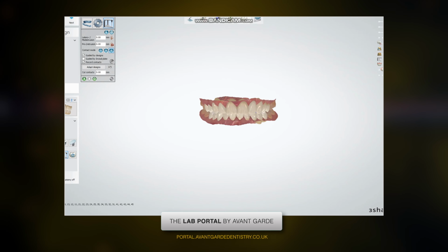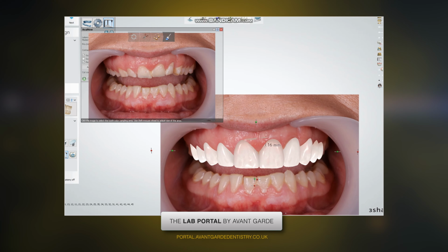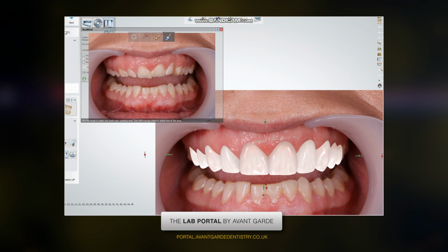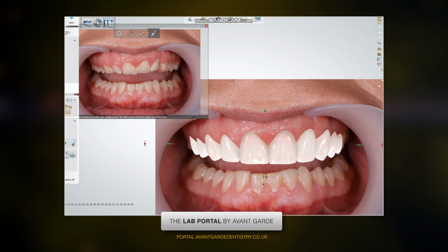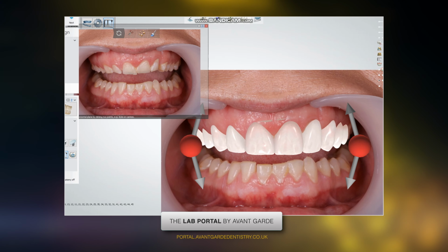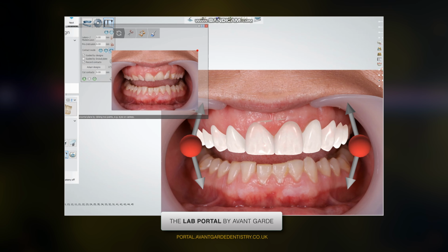Like I always say, the best articulator in a case like this is the patient's mouth in the form of the mock-up, especially in additive big wear cases like this. You should be able to really test everything thoroughly through the mock-up in the patient's mouth live. We have certain lines that allow us to see where the incisal edges are, and I will be able to show you in a second.